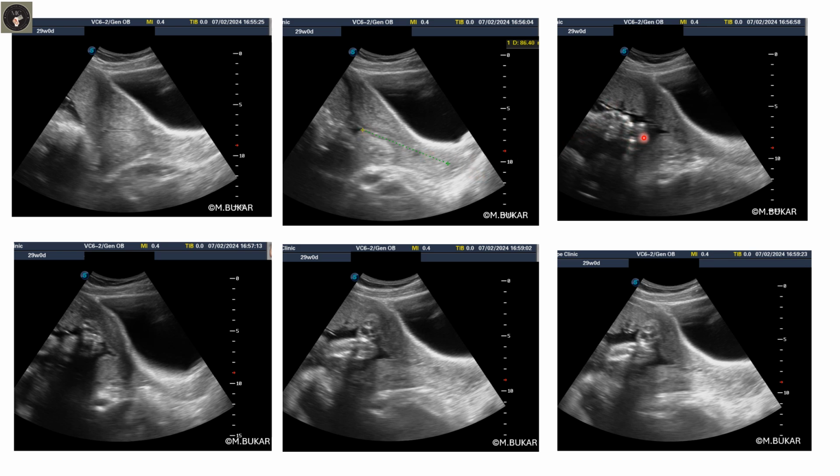After a while, look, the contraction is waning, and so the placenta is assuming its normal position. Again, look at the lower edge of the placenta now. Compare the lower edge here, when the contraction has almost gone, to when the contraction started. So this is a case of false placenta previa. Be wary of uterine contractions giving rise to false placenta previa.